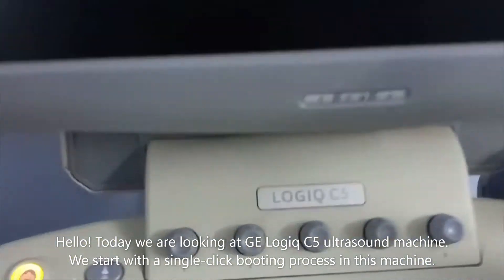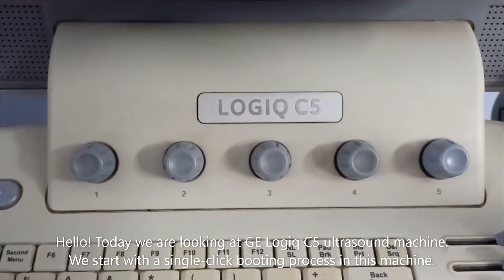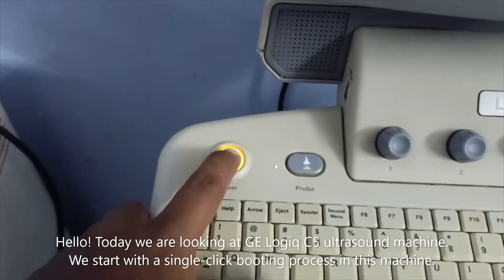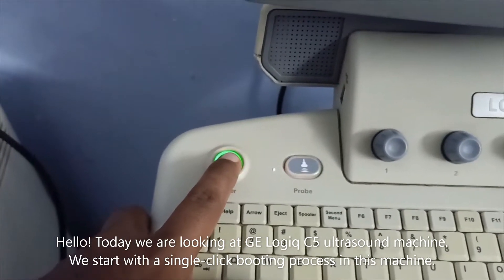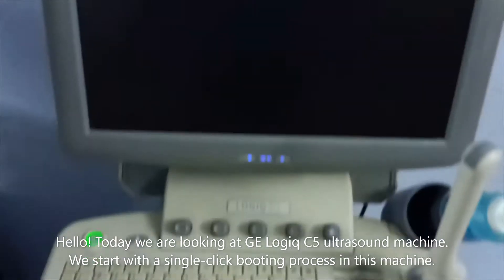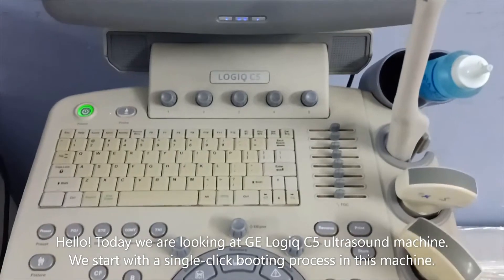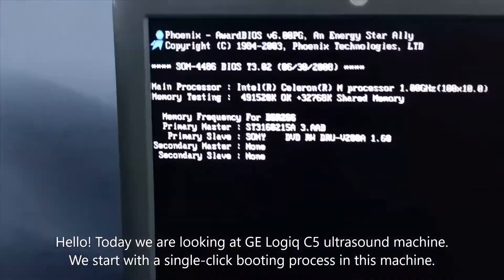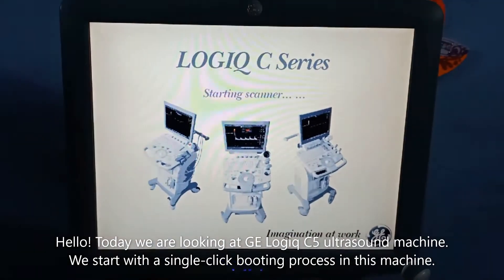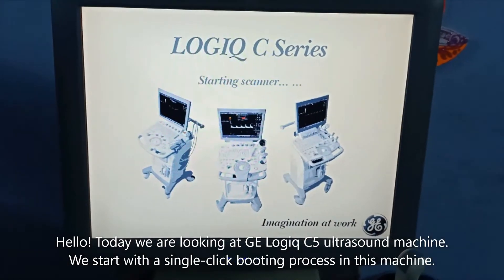Today we are looking at a Logic C5 ultrasound machine. With a single click the machine will start booting up, as you can see in the display. I will show you the booting process — once it is completed you will get the scan area.